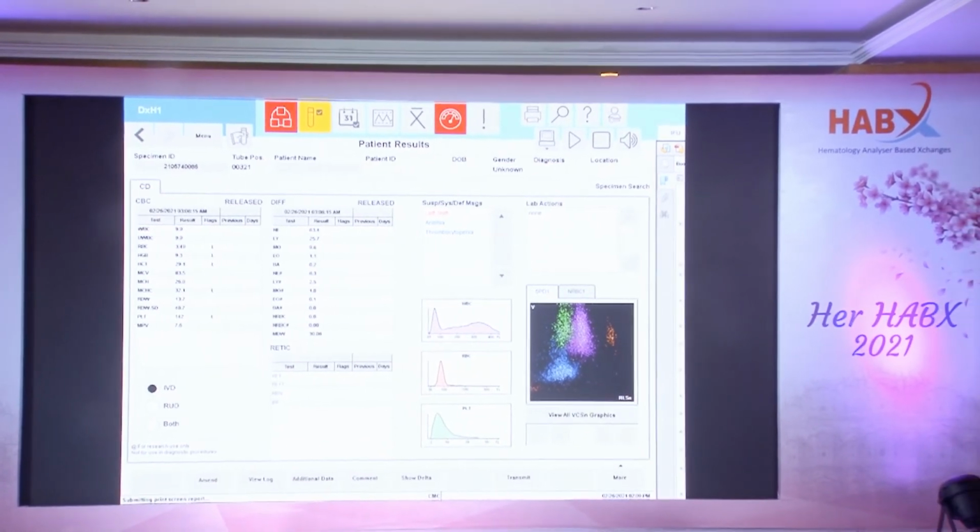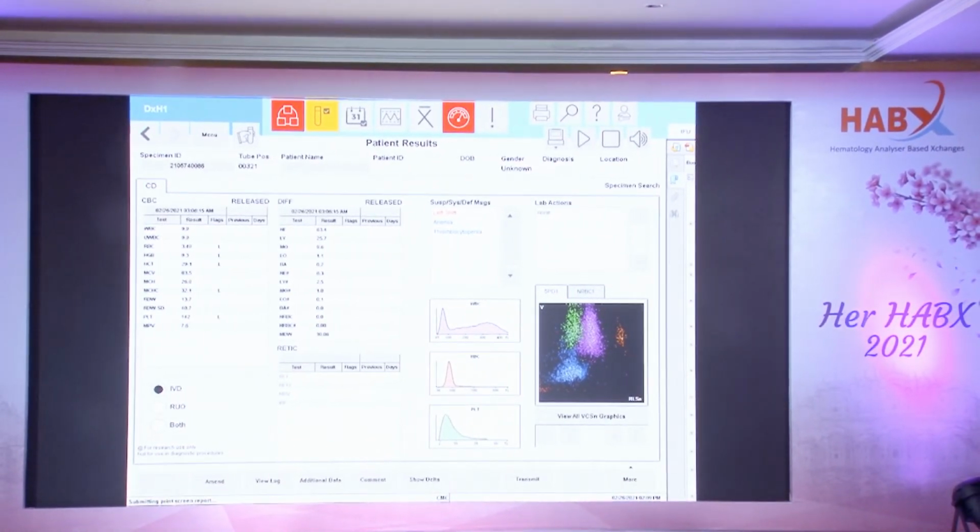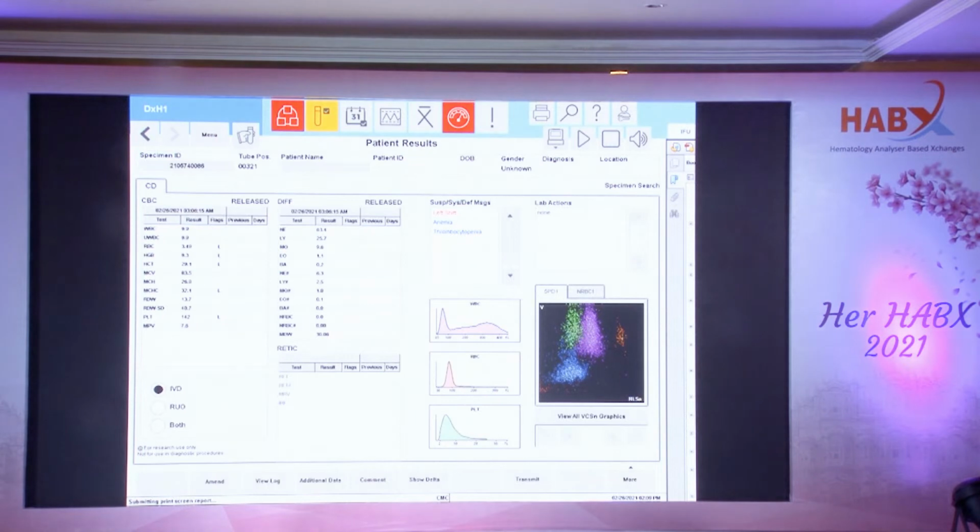Neutrophils have come out closer to the monocyte. Very simple. In sepsis, we have found out neutrophils are large. They have the same number of granules like they had before. Larger neutrophils, same number of granules, scatter will come down.